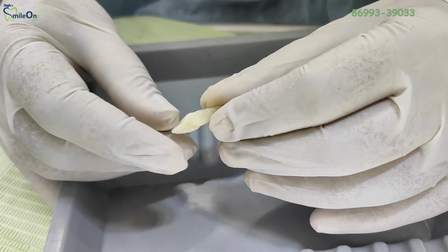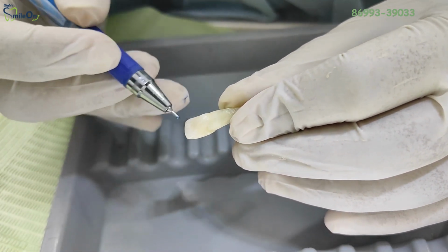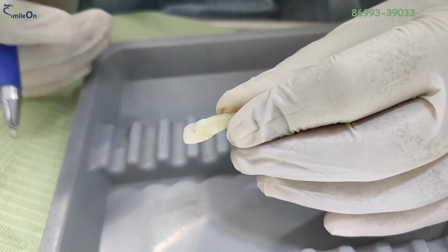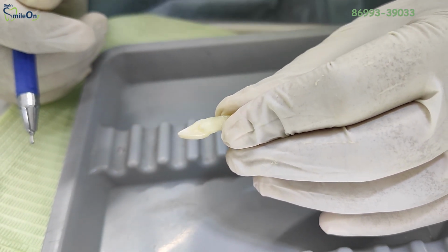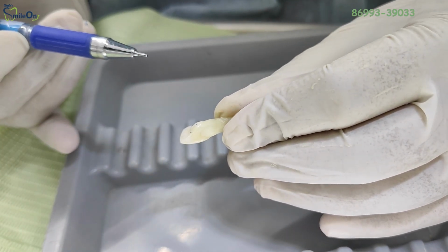In the crown, on the lingual side, we have a cingulum. You can clearly appreciate this is the cingulum. Basically, you can see it as a protruded part on the tooth. Now this will be an anatomic landmark for the access cavity preparation.